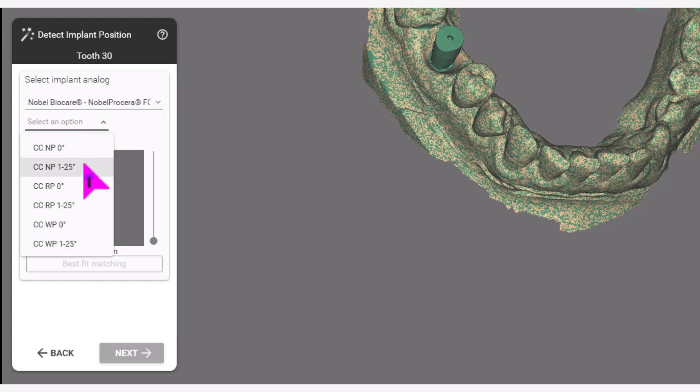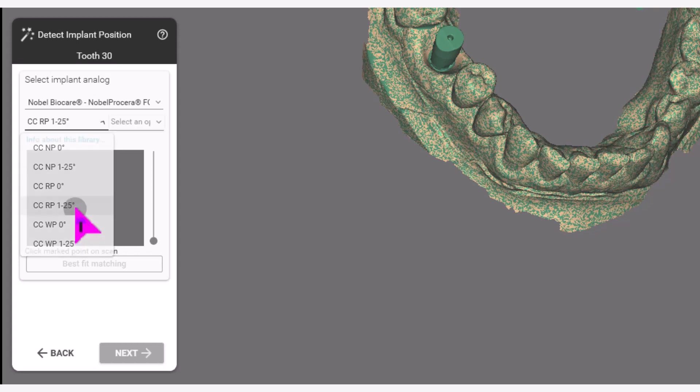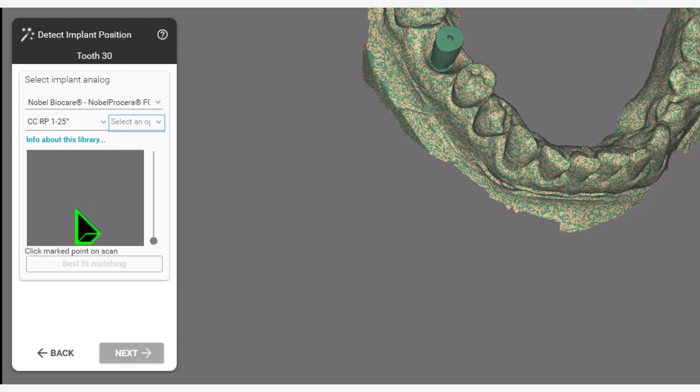Next, select the implant platform, size, and if you are doing an angulated screw channel. In this case, we will be selecting the conical connection regular platform 1-25 degrees, indicating the angulated screw channel.